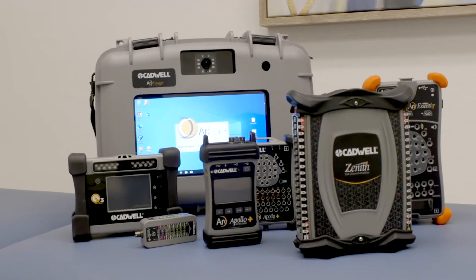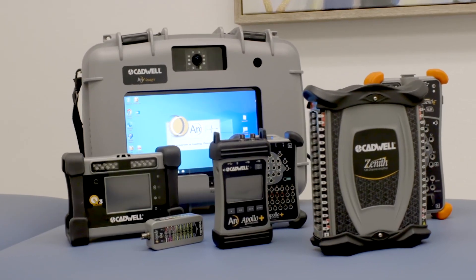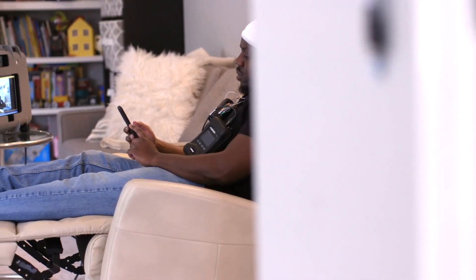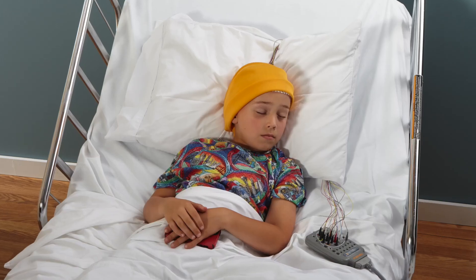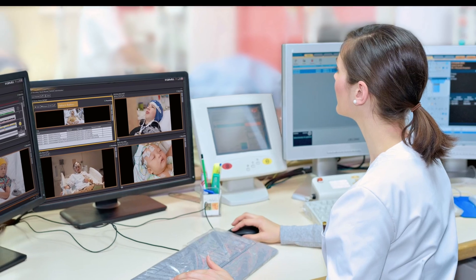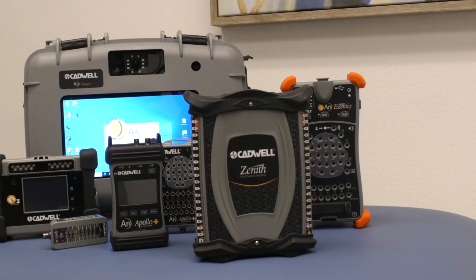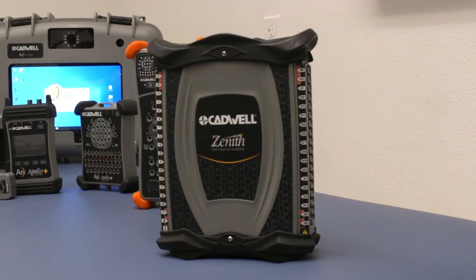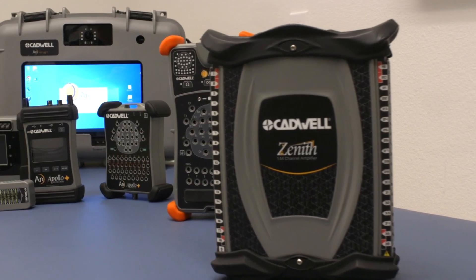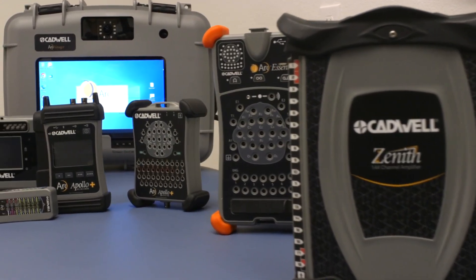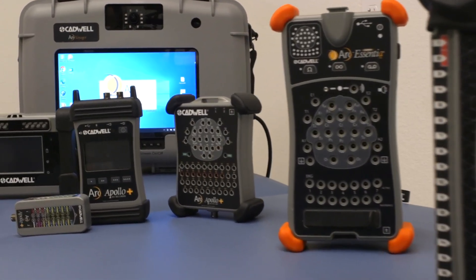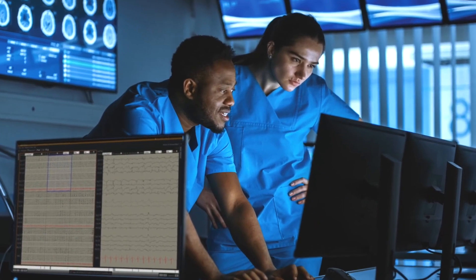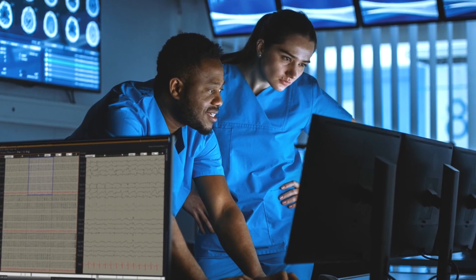Cadwell is helping patients and epilepsy care teams through every stage of the neuromonitoring journey, from routine clinical EEG and in-home remote monitoring to long-term and intracranial epilepsy monitoring. ARC EEG is the culmination of a decades-long collaboration with our customers, responding to advances in brain monitoring. We considered patient safety, signal quality, efficient workflow, and multi-user collaboration when we designed ARC EEG for you.